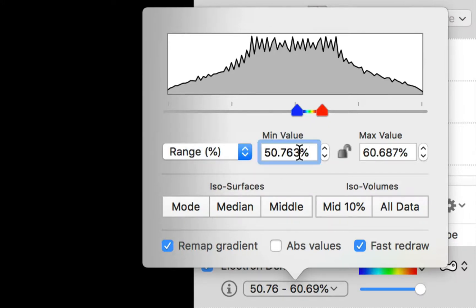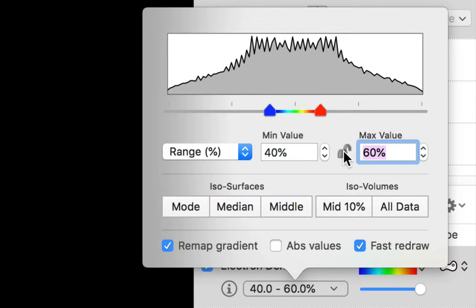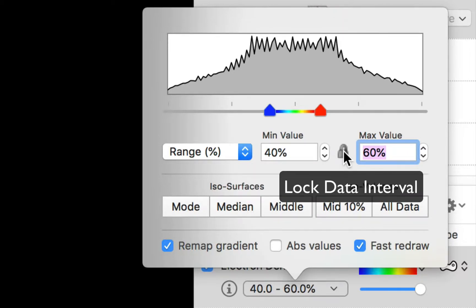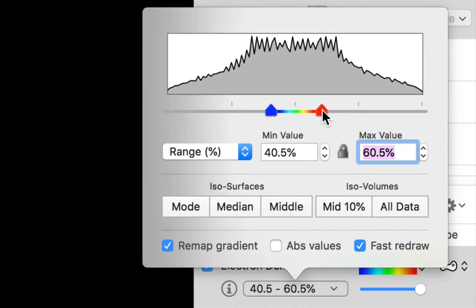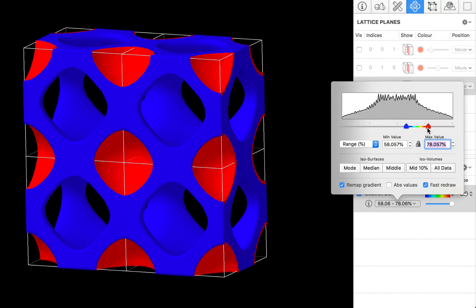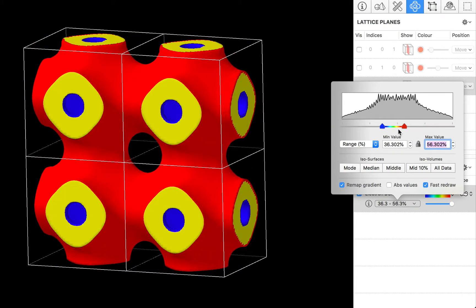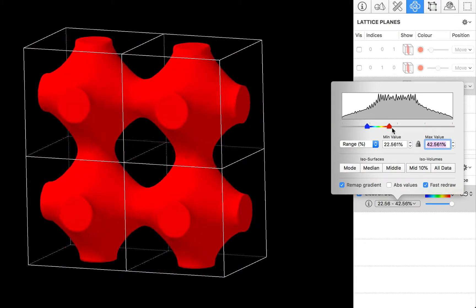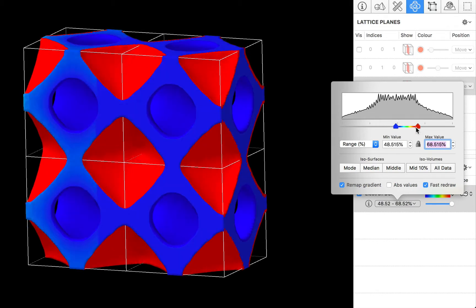So we might want to look at data between say 40% and 60% of our data range. Now what's quite nice is that you can use the little padlock here to lock that range interval. And then you can change the range by using these stepper controls and the minimum will change as well as the maximum. Or you can go to the scroller here and we can click and drag. It's actually a slider control and we can click and drag to investigate a fixed interval but with different starting and ending values.